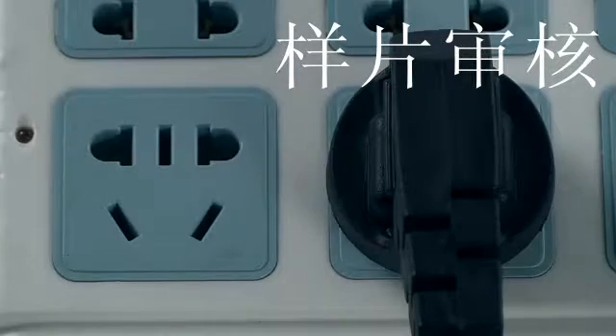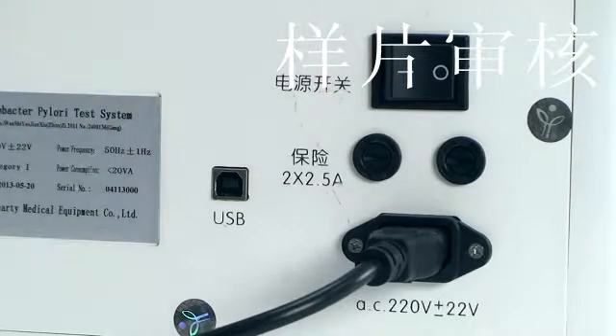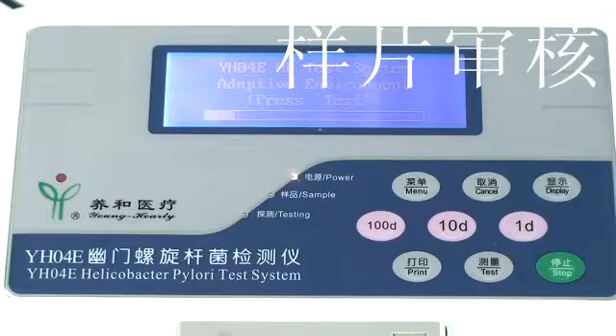This detector does not require manual calibration or debugging. The first time you use the detector, plug it in, turn the power switch on, and wait one hour before use.